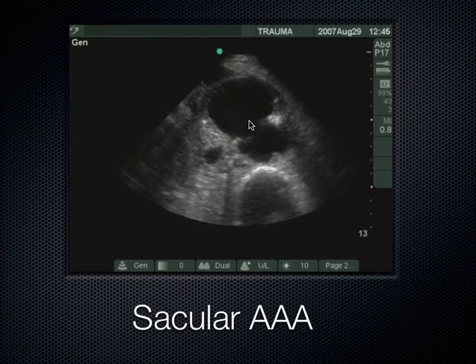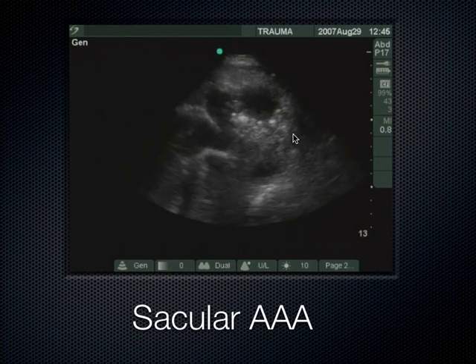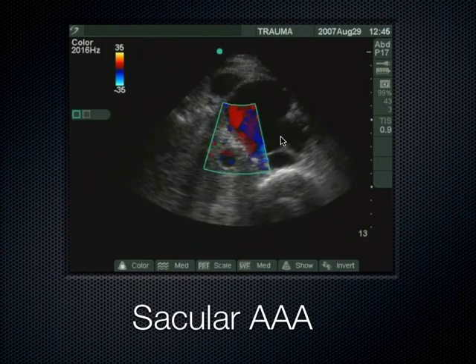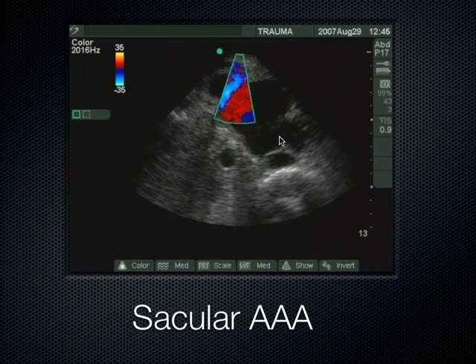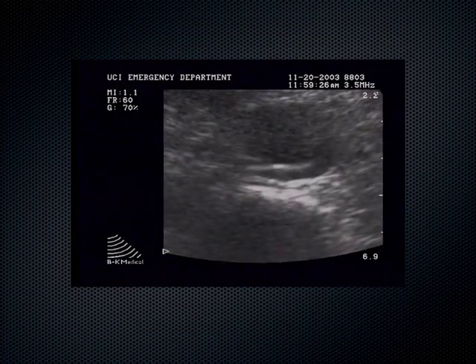So it looks like when they're saccular, we can see there's a saccular kind of thing coming off over here. See this little saccular aneurysm there? And there's one, I think, that extends this way on some of these cuts as well. You could throw some flow on there to see kind of what's lighting up. You'll get flow going to and fro all over the place.